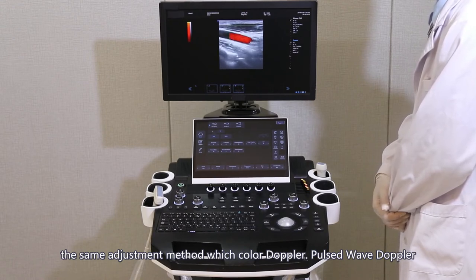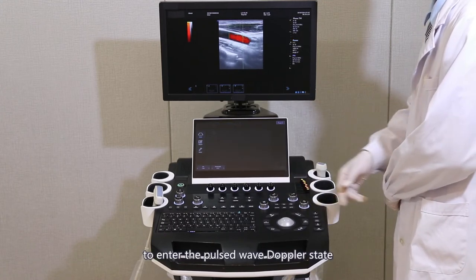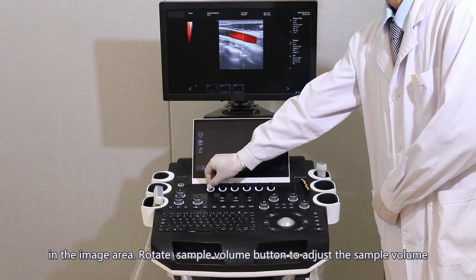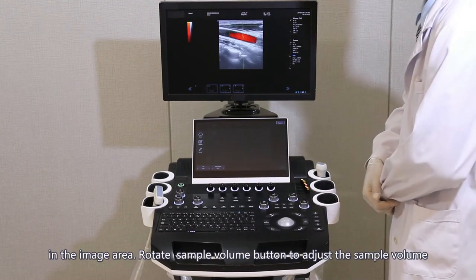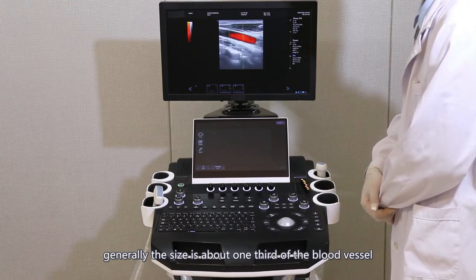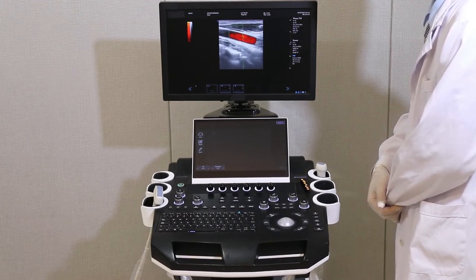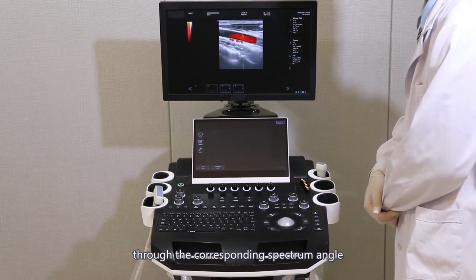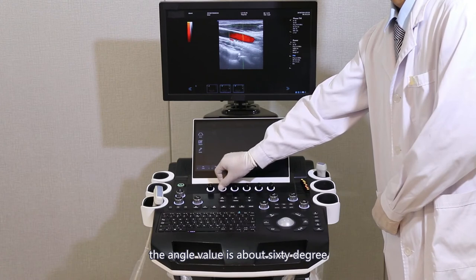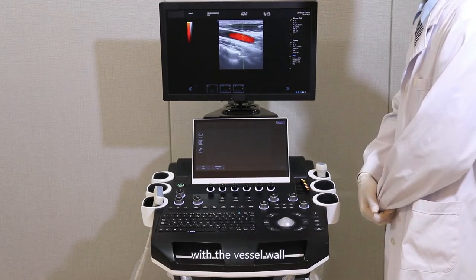Pulsed wave Doppler: when examining the blood flow spectrum, press the PW-knob to enter the pulsed wave Doppler state. At this moment, the sample volume appears in the image area. Rotate the sample volume button to adjust the sample volume. Generally, the size is about one-third of the blood vessel diameter.